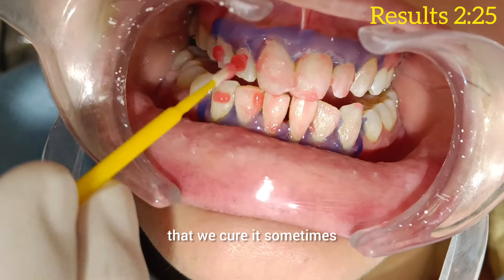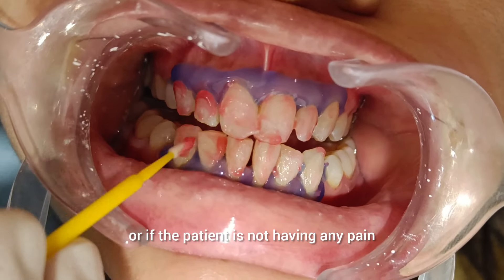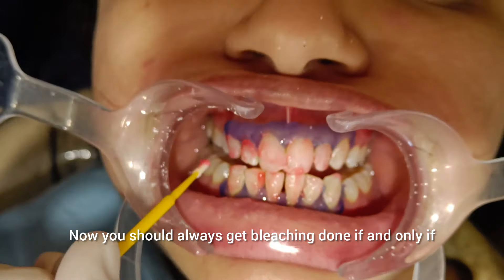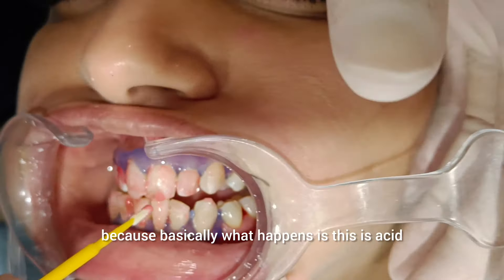After that, we cure it sometimes if the patient is not feeling sensitive or if the patient is not having any pain. Now, you should always get bleaching done if and only if you actually feel that you require it a lot. Because basically, what happens?